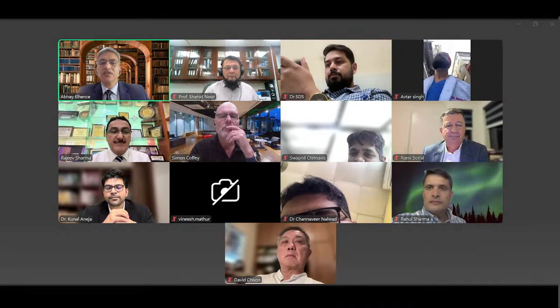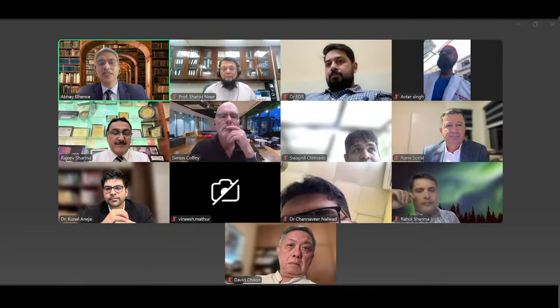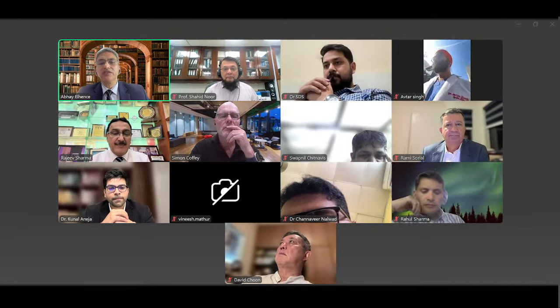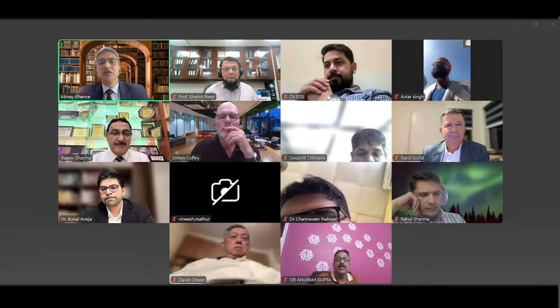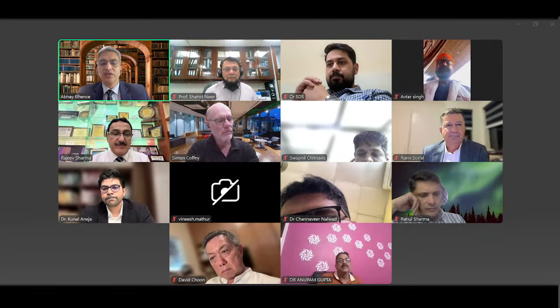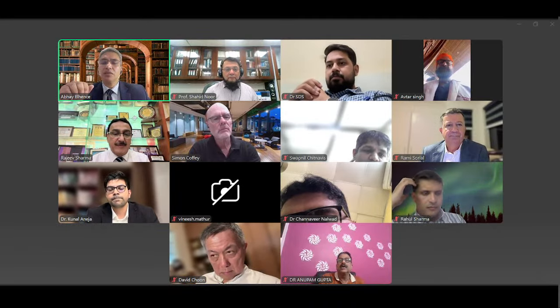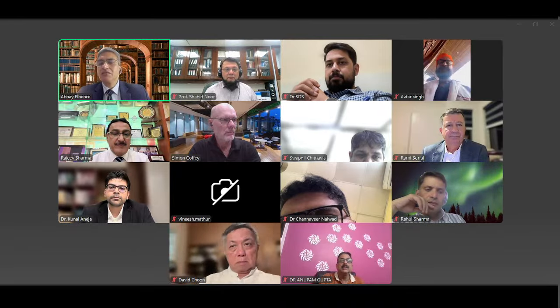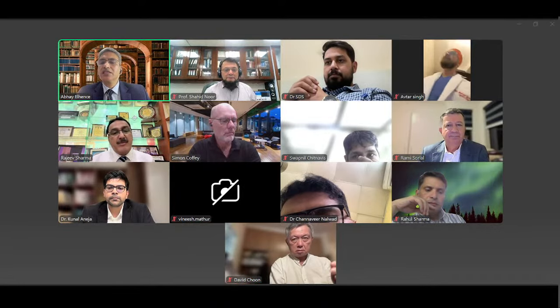That is a surgeon-specific thing. The second blow, however, has shown not to give any additional stability, but that is a surgeon-to-surgeon specific variation. And most of the secondary stability, which we aim to achieve with our second, third, fourth blows, which are usually not required, comes from the fact that when the patient loads on full weight bearing after the total hip, that secondary stability is achieved.